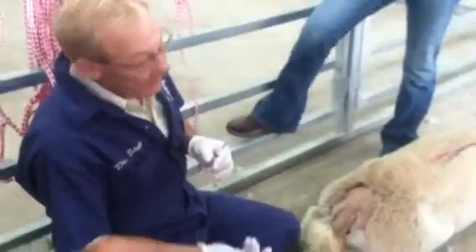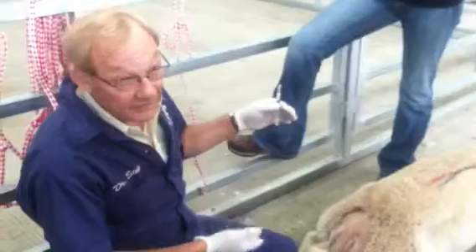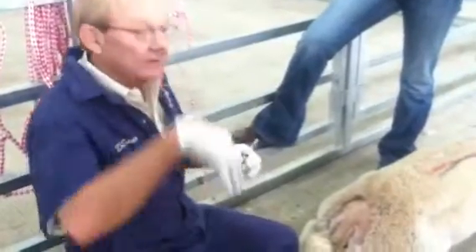Then I usually stick around — by the time I'm cleaning all the stuff up and cleaning myself up, the animal gets up on its own.